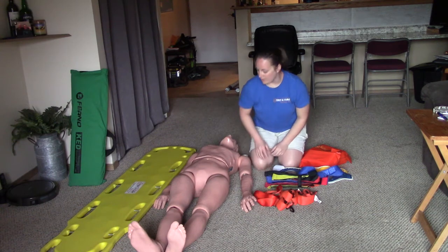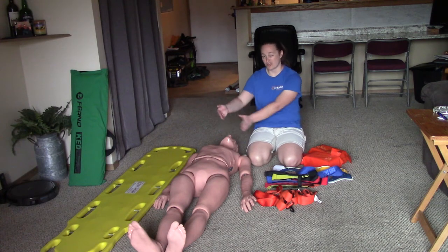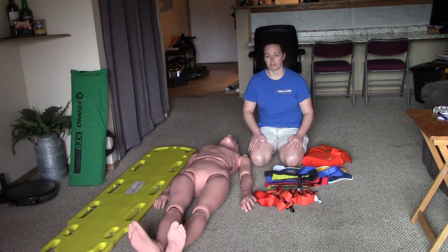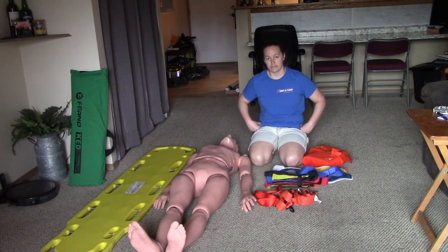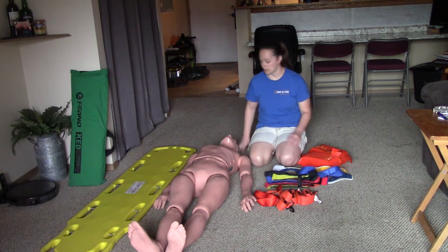The goal of backboarding is to keep our patient's spine immobilized — we want to keep their entire spine straight and secure as we put the patient on the backboard, and then secure all the major parts of the skeleton to the board. The major parts are the shoulders, the ribs, the pelvis, the femurs, and the lower legs. Both types of straps secure those five parts of the body.